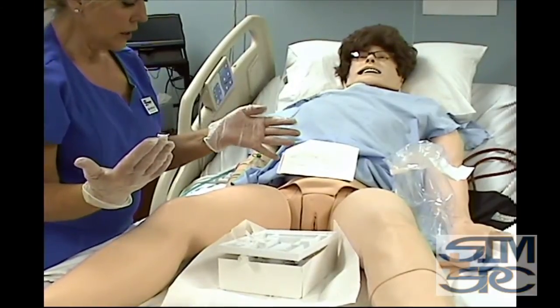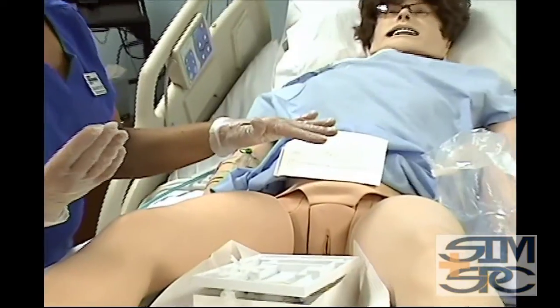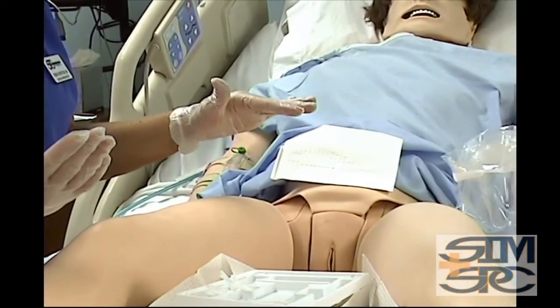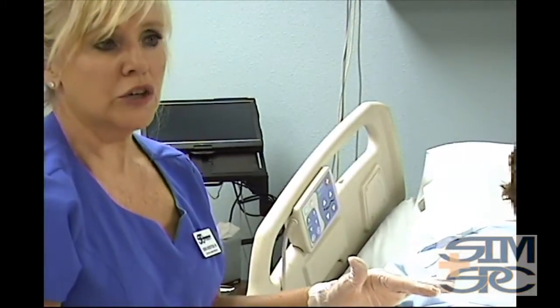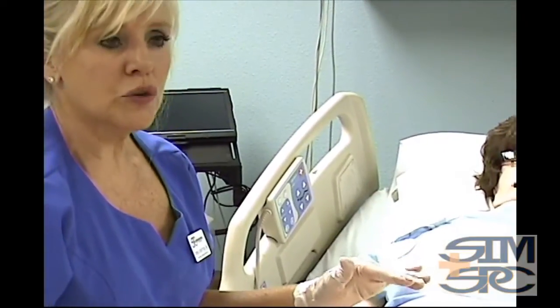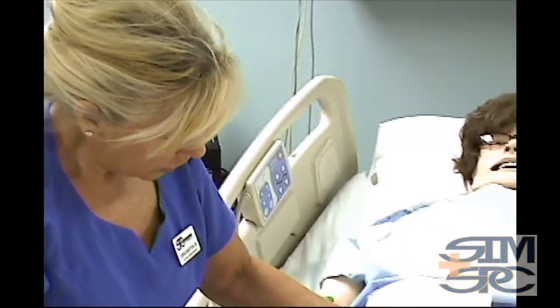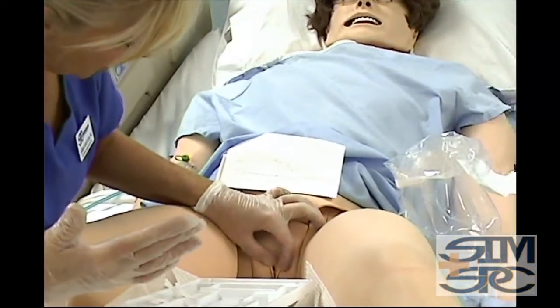Once you put your hand on the labia to spread it, you cannot take the hand off. If you do and remove it, then the labia folds back over where you're going to insert over the meatus, and it's going to be considered contaminated. You're going to have to re-clean. So you want to make sure once you get your hand placed that you keep it positioned. So what we're going to do is move back the labia. Okay.